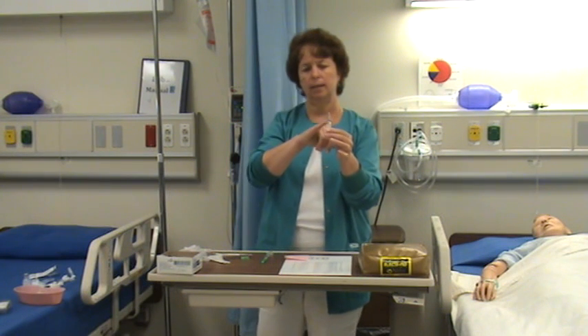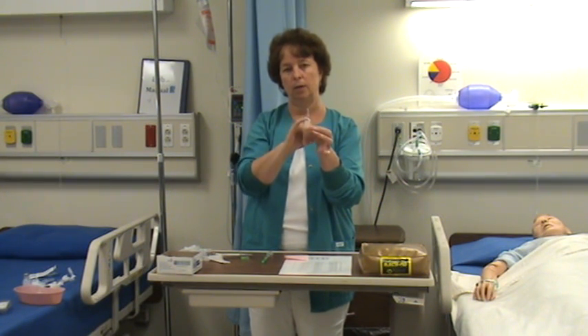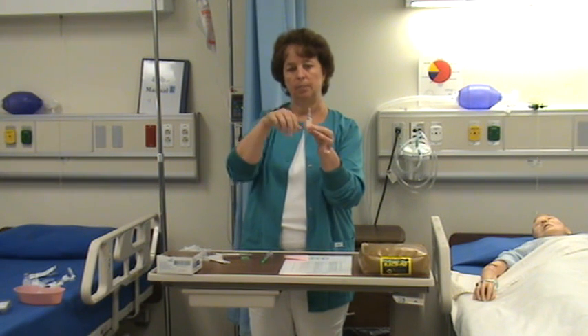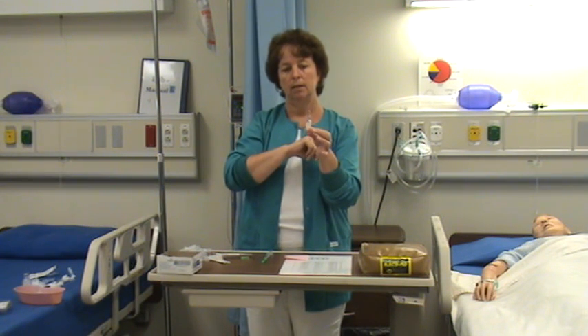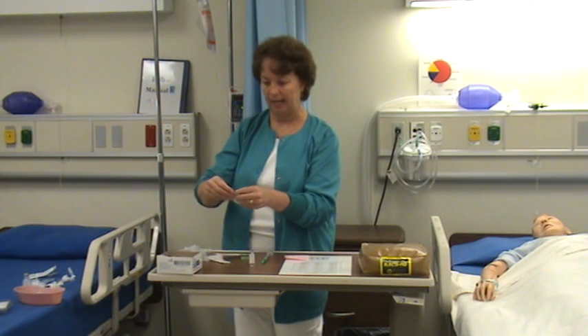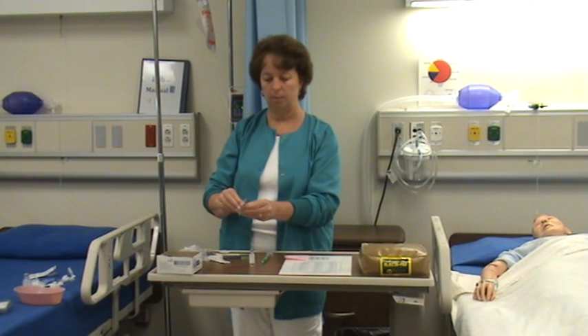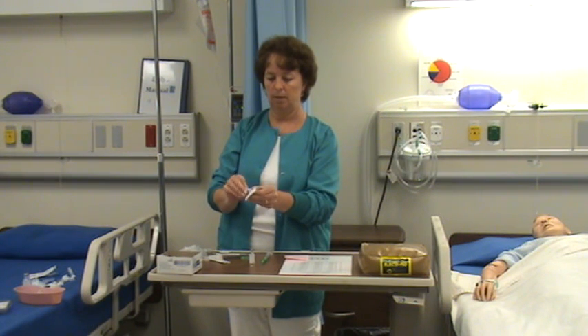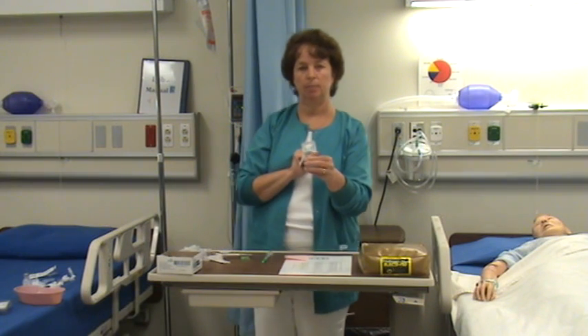An ampoule has a top and bottom piece with a narrower section between the two — that's where you're going to break it. Sometimes it has a marking; this one has a little blue circle around the break area. To prevent injury to your hand, you can take a two-by-two or four-by-four gauze, or sometimes I use the alcohol swab and place it over the top of the ampoule when I break it.